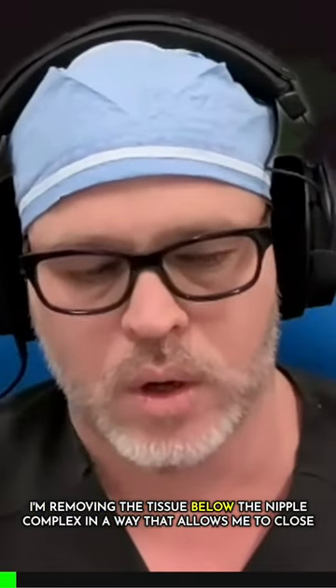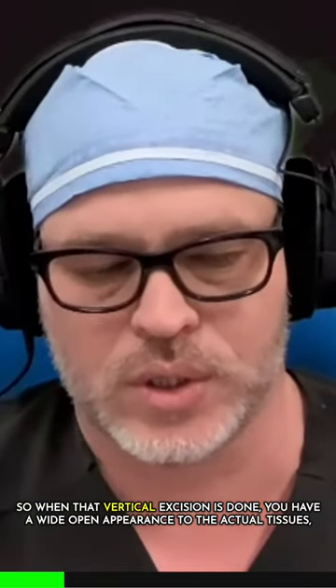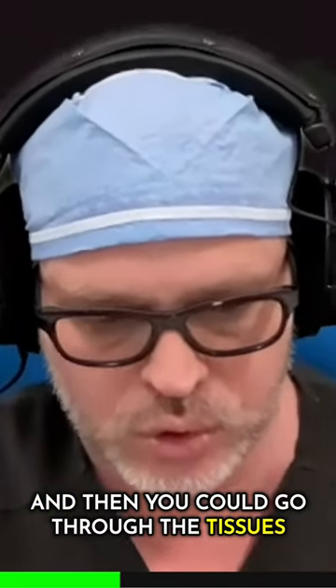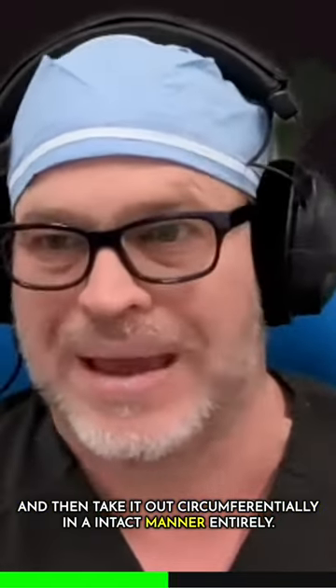I'm removing the tissue below the nipple complex in a way that allows me to close and lift at the end. So when that vertical excision is done, you have a wide open appearance to the actual tissues, and then you can go through the tissues and expose the implant's scar capsule and then take it out circumferentially in an intact manner entirely.